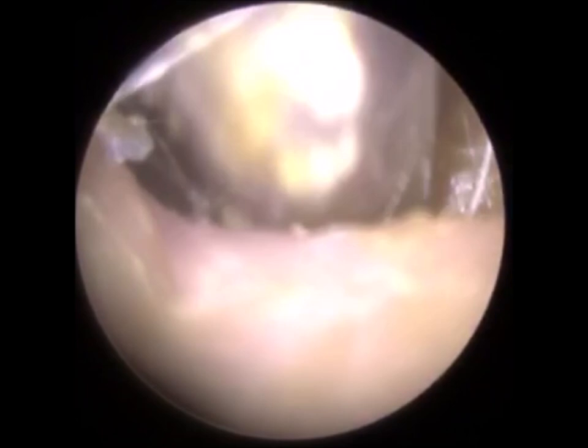You can see you get a reflection. So keratin's white. When we have light shining from the endoscope on a white surface, you do get reflection. And that's why it's so bright at the moment, because it's like with any object. White objects reflect light more than dark objects, and that keratin was so white, it was causing a glare. Still struggling to get this last piece of keratin out of the ear.